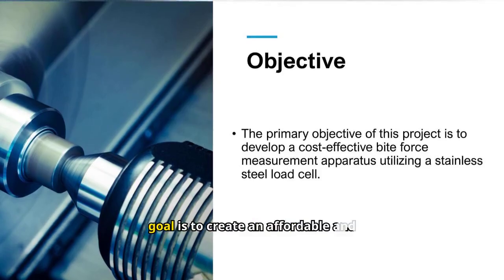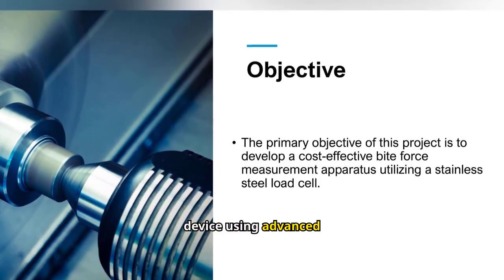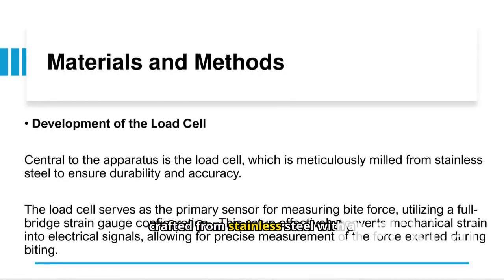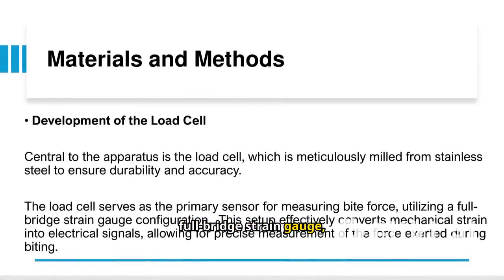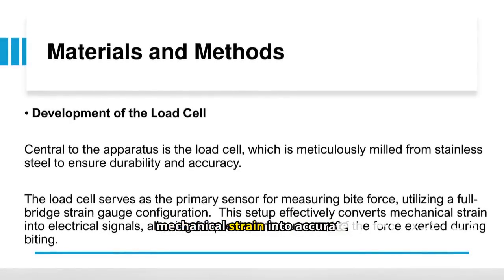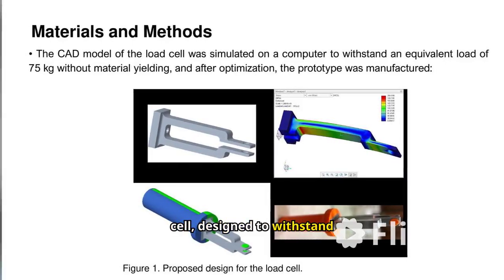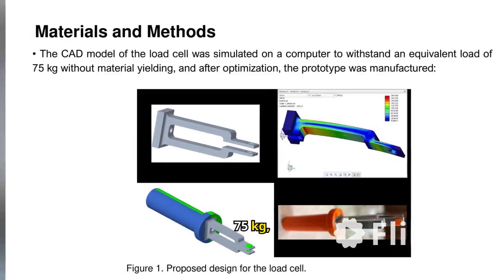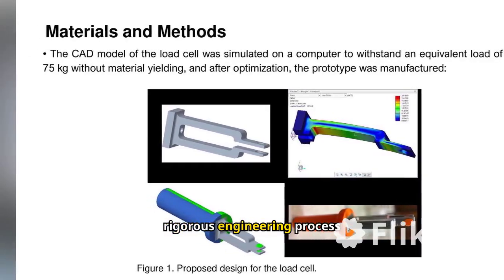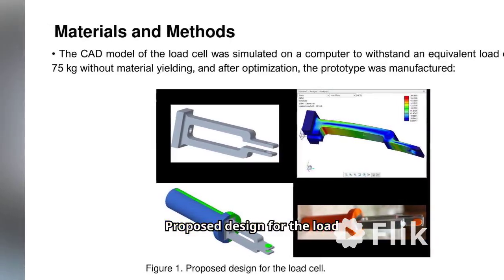This project's primary goal is to create an affordable and efficient bite force measurement device using advanced stainless steel load cell technology. The load cell, crafted from stainless steel with a full-bridge strain gauge, ensures precise bite force measurements by converting mechanical strain into accurate electrical signals. A CAD model of the load cell, designed to withstand 75 kilograms, was optimized and prototyped, showcasing the rigorous engineering process behind the apparatus.